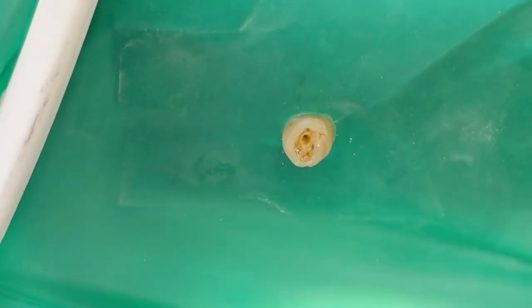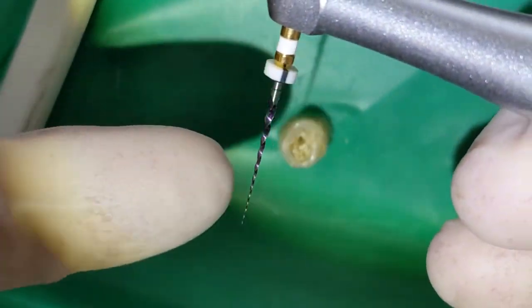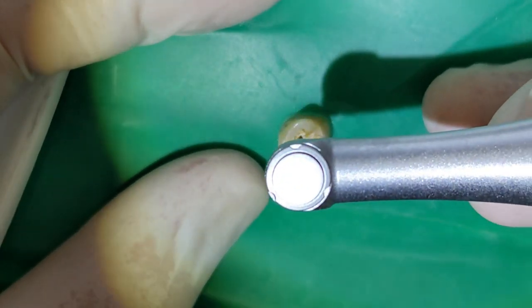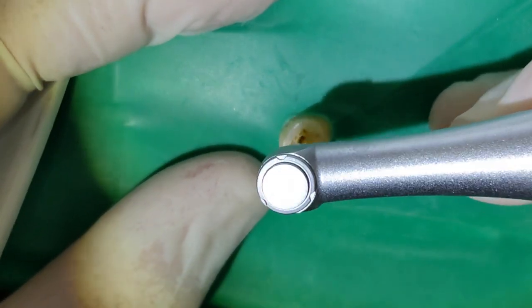Once I'm into the nerve chamber, the first rotary file I'm going to use is a pathfinder file. It establishes the glide path for the rest of my instruments. Just work it in and out.